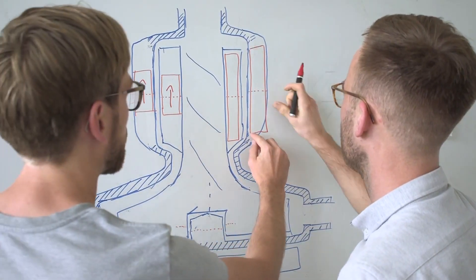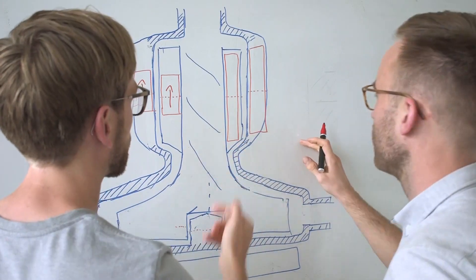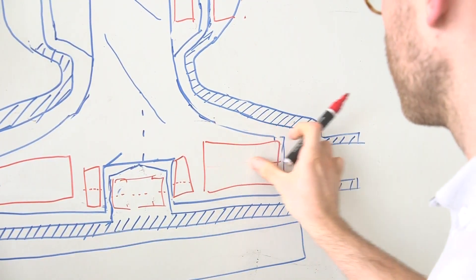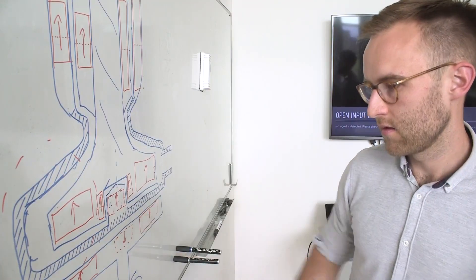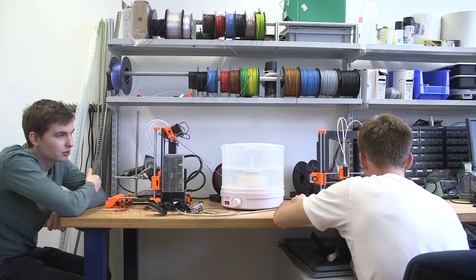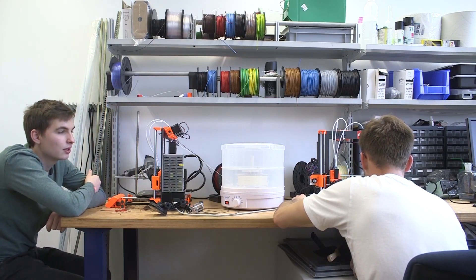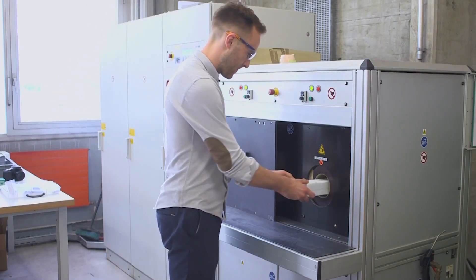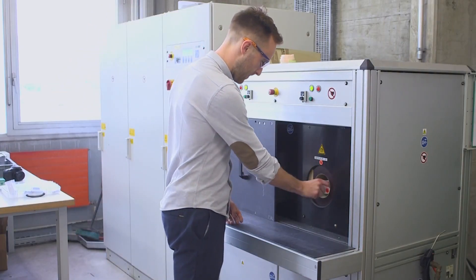Critical components of a rotary blood pump are the magnets. To print them directly into the parts while printing the pump itself, we developed a process that we call embedded magnet printing. We are printing a filament of a magnet powder-polymer composite in a conventional fused deposition modeling printer and then magnetize the part in a strong magnetic field.